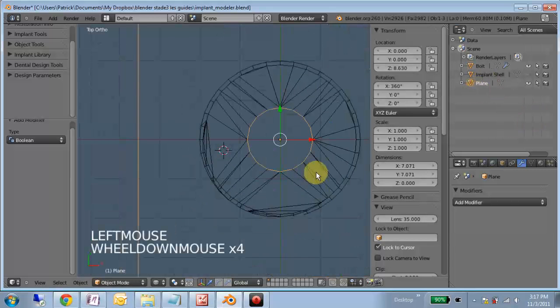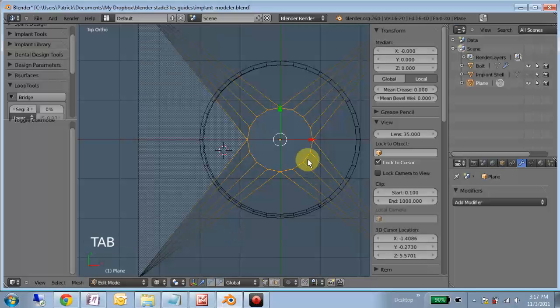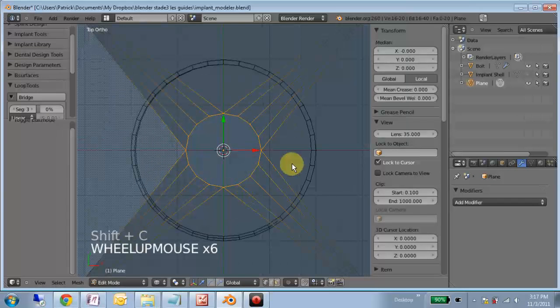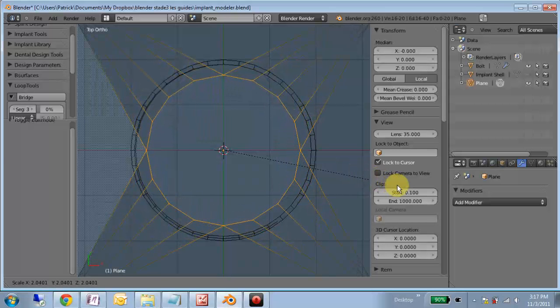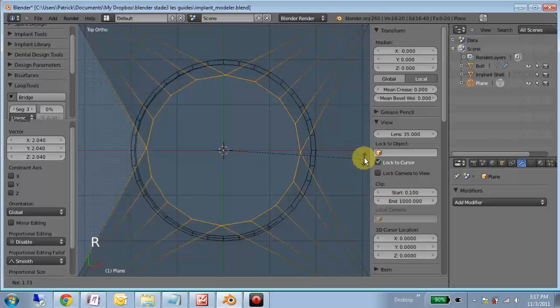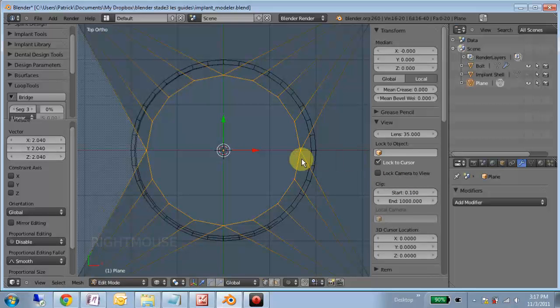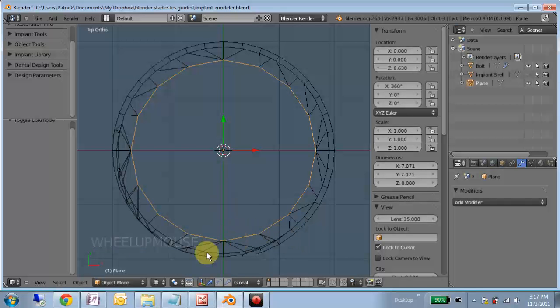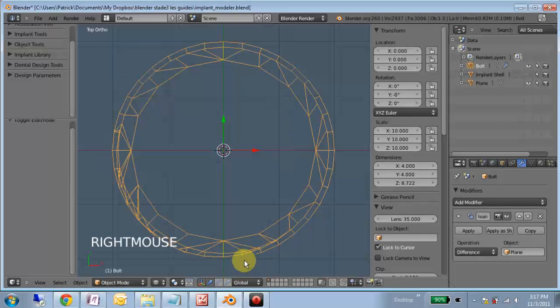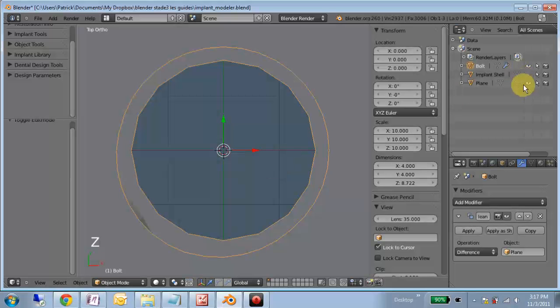I'm going to select the plane, tab into edit mode. I'm going to scale these up here so they're pretty close. I may even rotate them a little bit or possibly subdivide. So when I tab out of edit mode, you see we get a little bit better access to this. There aren't as many cords cutting across. We may still have a few, but that greatly decreases it. Okay, out of wireframe mode, hide the plane.